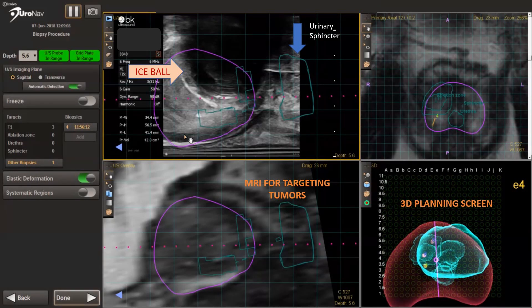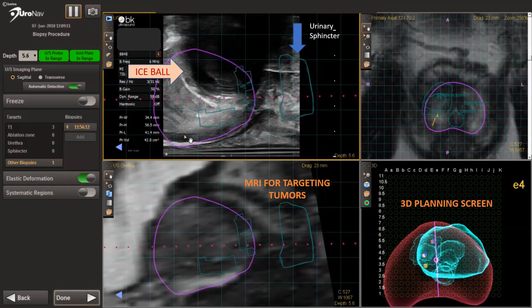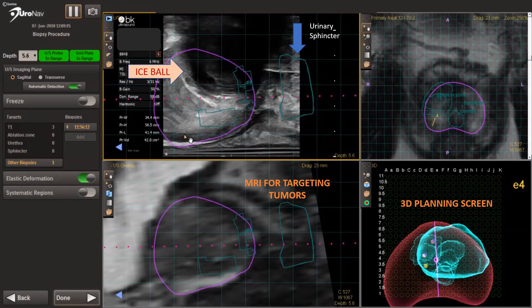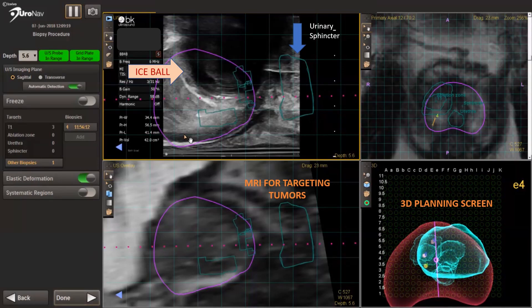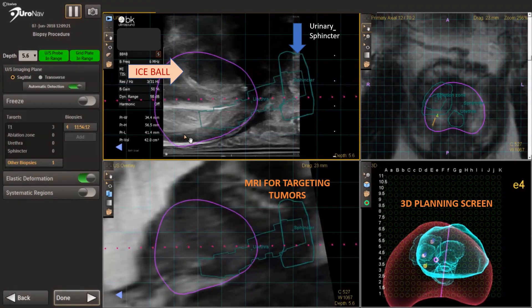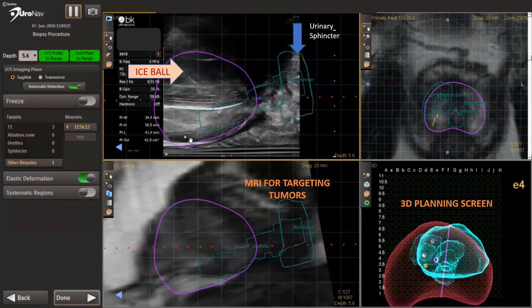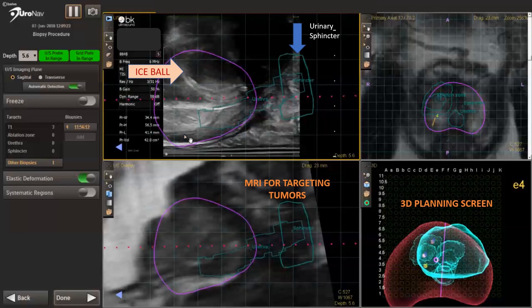Again, for orientation, in the lower right-hand corner of the screen, you can see our 3D image overlaid on the grid where we stuck the needles through, and the lower bottom left is showing the 3D region of interest that has been created from the patient's MRI.